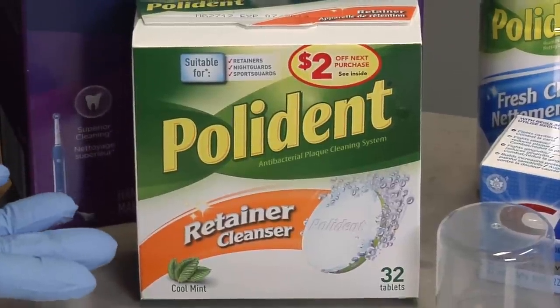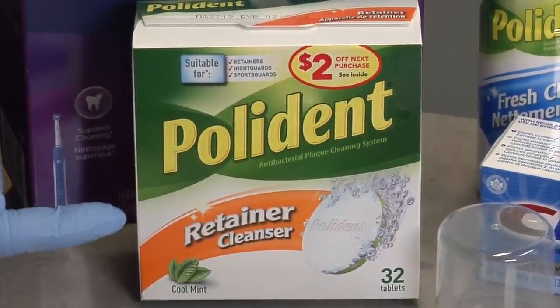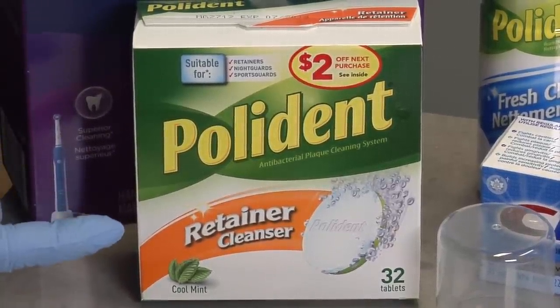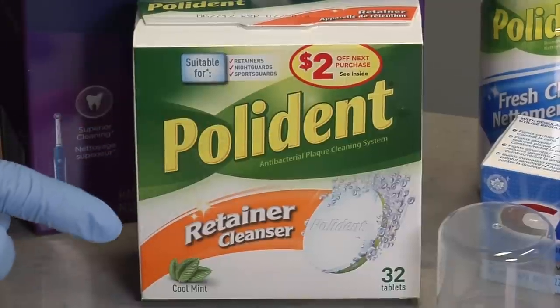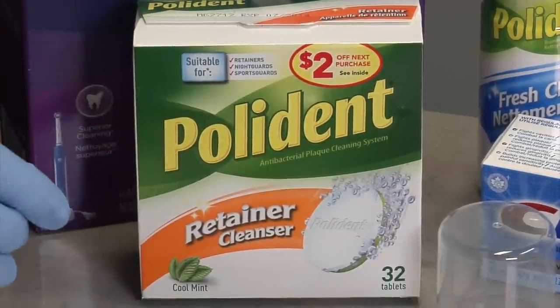As another option to clean your aligners, you can also use Polident's Retainer Cleanser. Just use room temperature water, put your aligner in a glass of water, drop in one of the tablets, and it only needs to sit for five minutes.